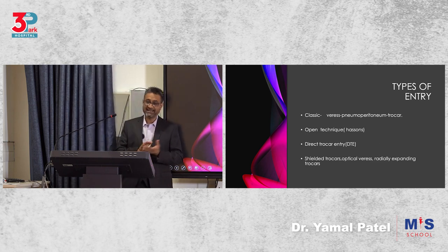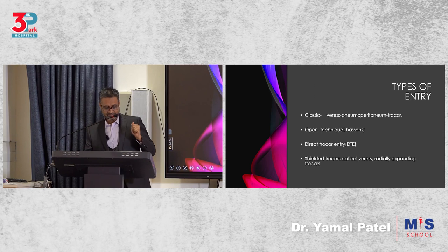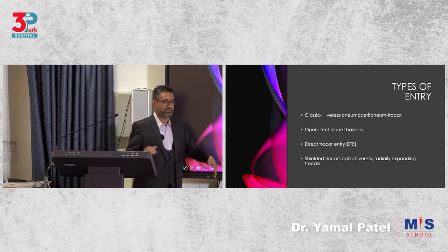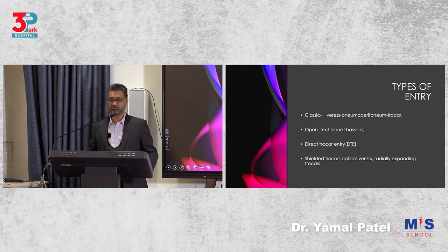We have the following types. We have the classic Veress pneumoperitoneum trocar entry. Then we have the open technique, which is Hasson's. And we have the direct trocar entry, which I told you I use. And then we have the optical entry, where you would go in with, let's say, the camera attached to your trocar and go in together under vision.